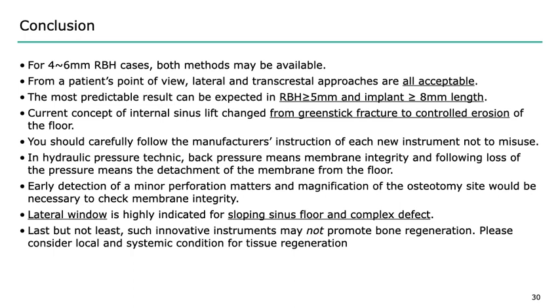Last but not least, such innovative instrument may not promote bone regeneration. It's all focusing on the membrane integrity. Please consider local and systemic condition of the patient for tissue regeneration.